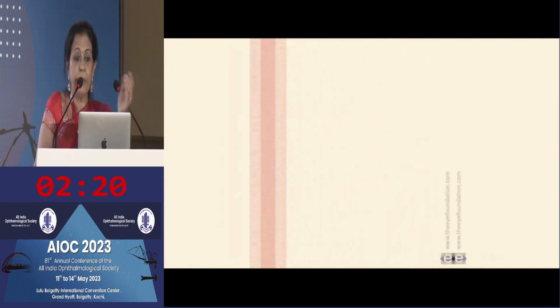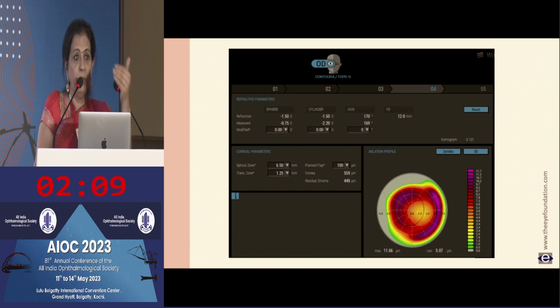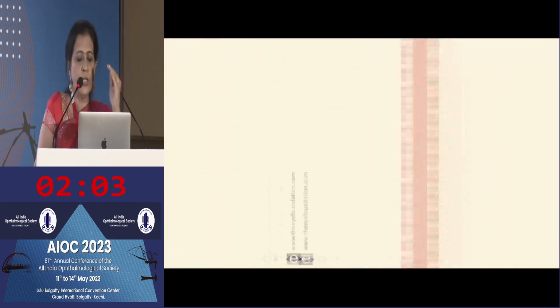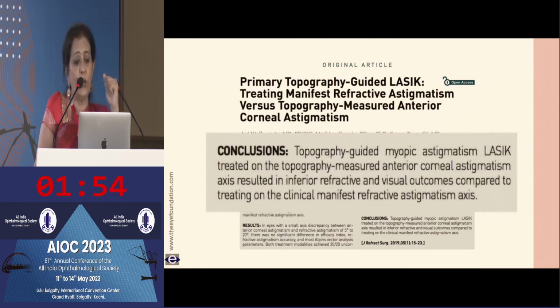Similarly, in the second map, these are those small gray areas wherein you are not sure whether you do a contour, because there is some kind of a refractive impact by correcting more aberrations than normal. Keeping this in mind, different studies were done, and what they showed was that doing it based on just topographic refraction and axis was definitely not superior to doing it on the manifest.